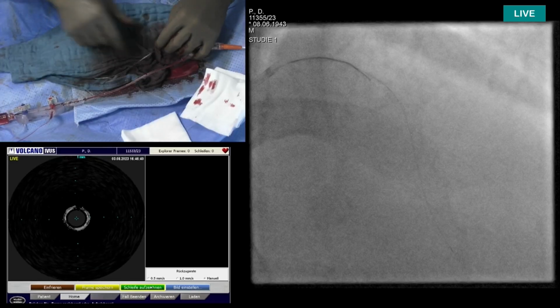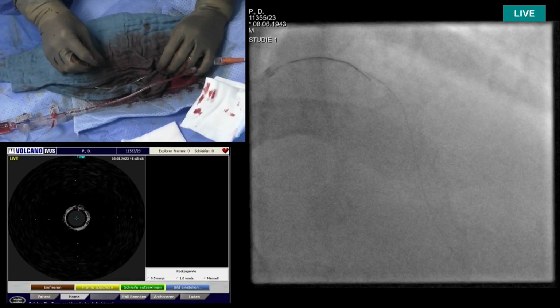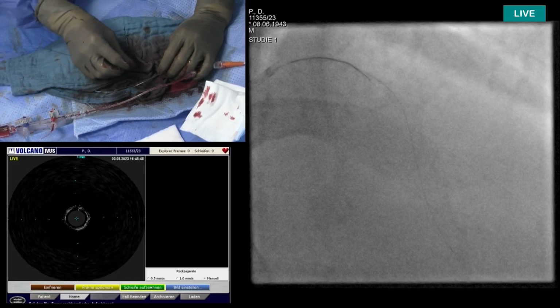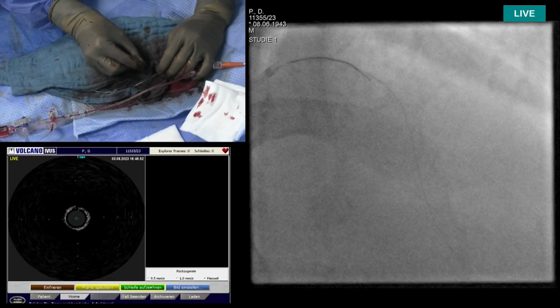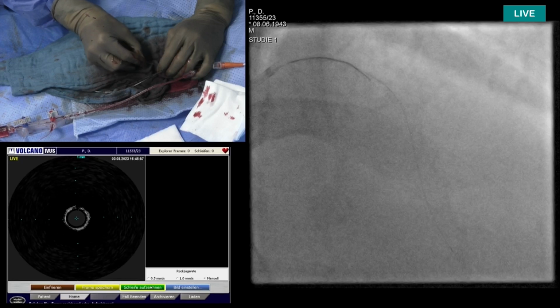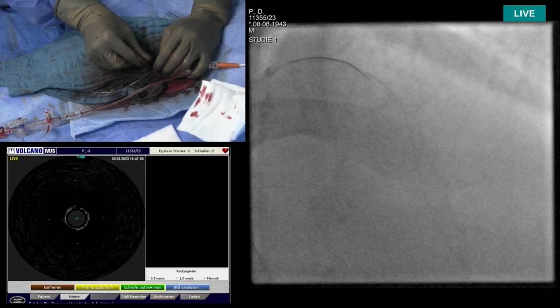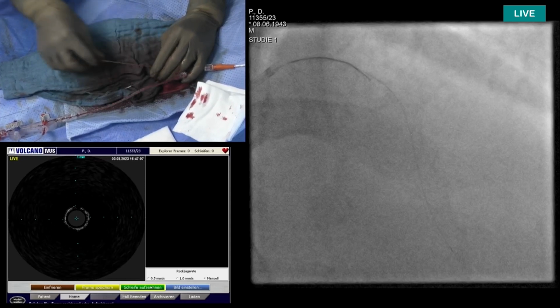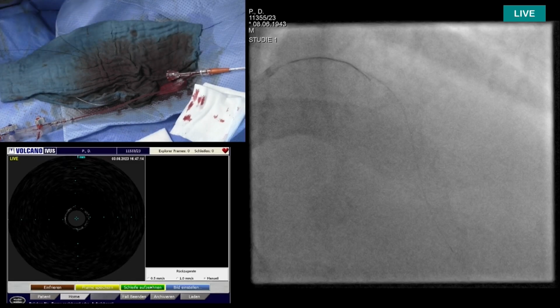Just one comment. Obviously, in this case it's not possible because the catheter doesn't cross. But the critical step in a complex lesion like this is the information you get from imaging post-rota: the effect of rota, whether you need to do more, whether you need to cut or shock, or change the wire because of wire bias to ablate other segments of the vessel. That would have been richly informative. So it's obviously a critical step. Do you agree with that, Daniel? I think that comment is perfect.